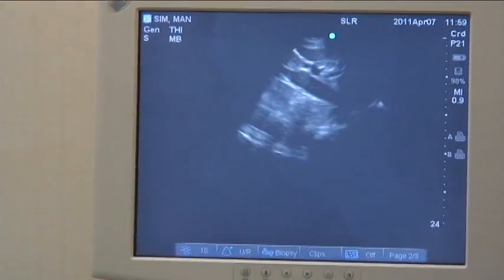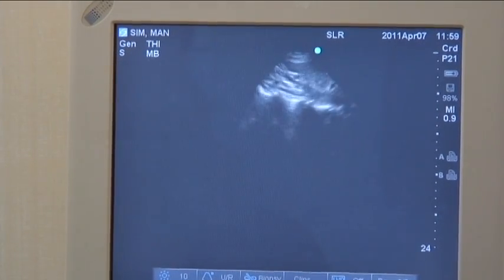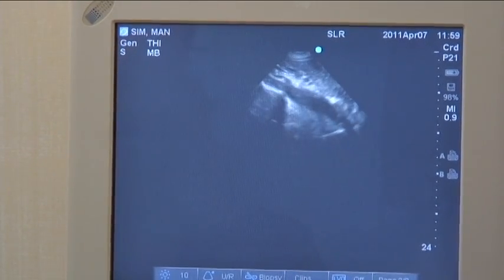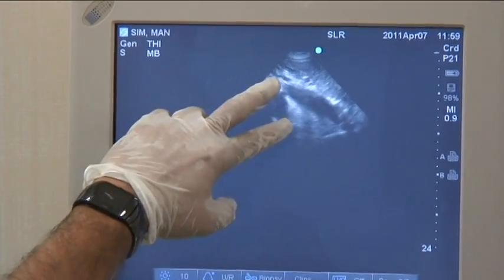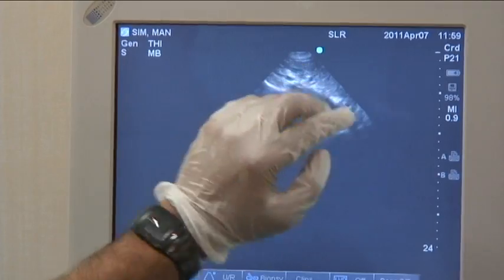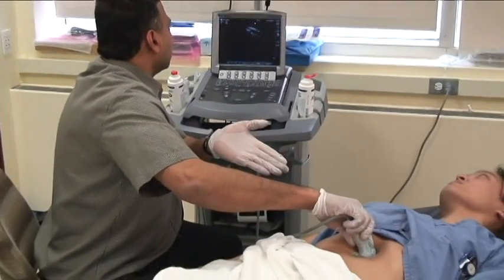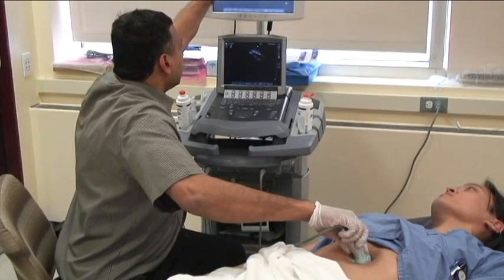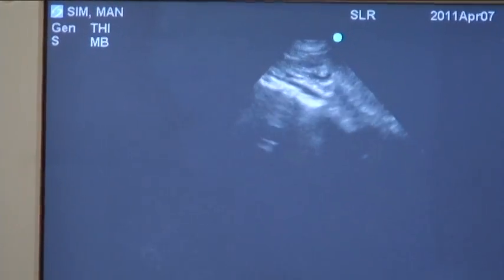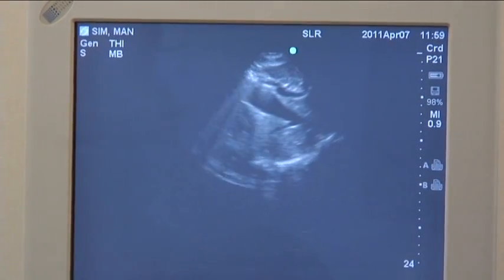Now you have to be a little bit careful about identifying, I'm going to show you, this is the aorta, okay? Now, you have to be a little bit careful that you don't confuse the aorta. You notice that my probe is pointing to the left. That's where the aorta is. You notice that the walls are hyperechoic, and it's pulsatile. We slowly point back to the right, and there you have the IVC there.